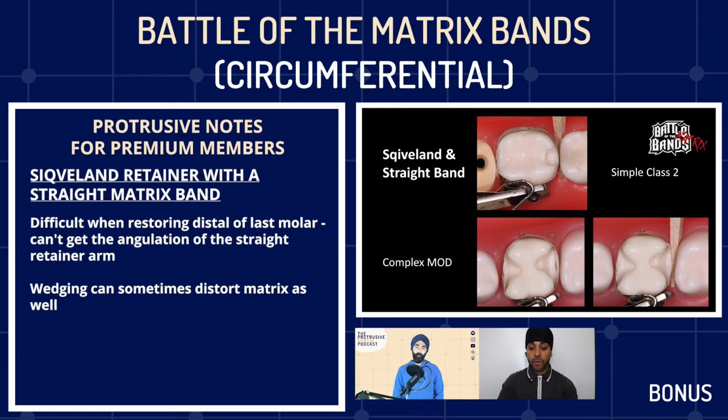Good point. Now, if you're using this Siqveland matrix band and you find that when you put the wedge in, you've got a slight open contact, so not like a major open contact that you see there, but you've got a slight open contact.